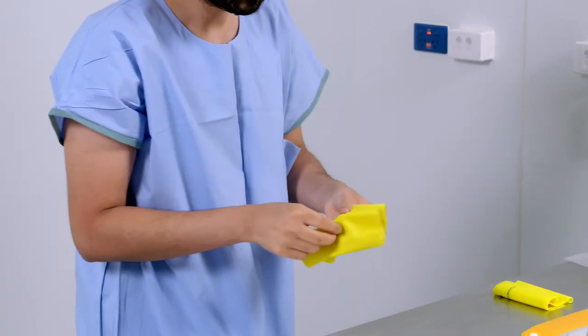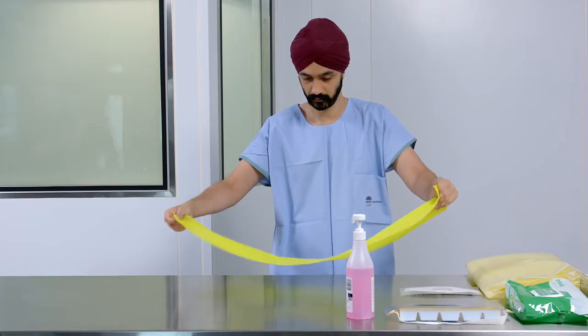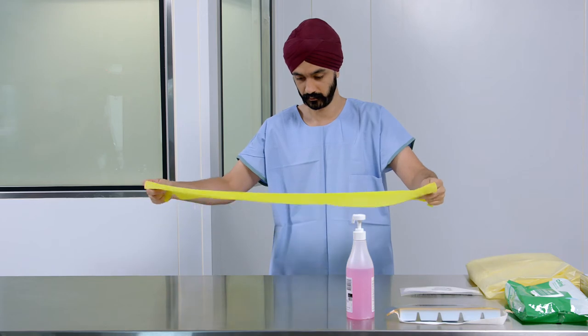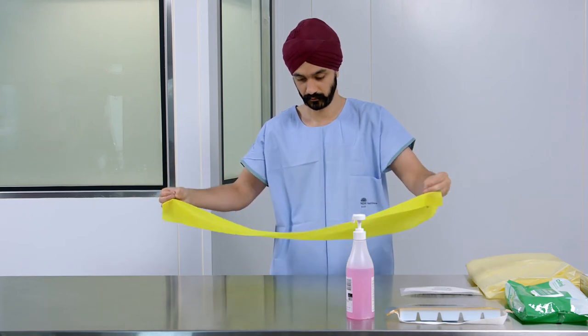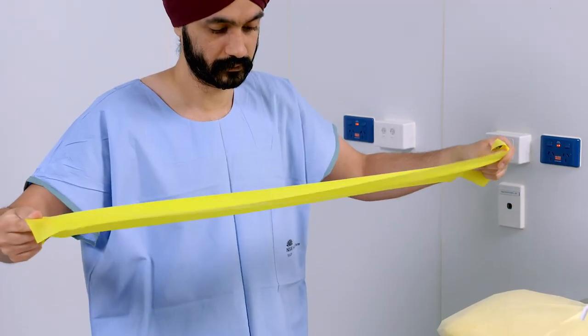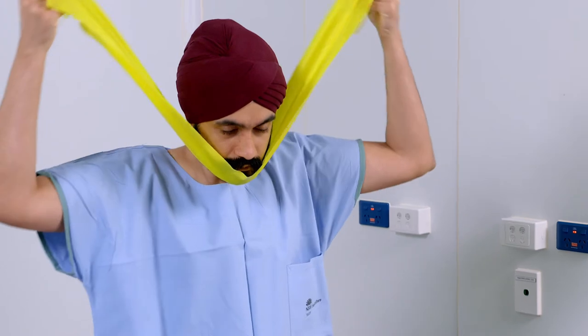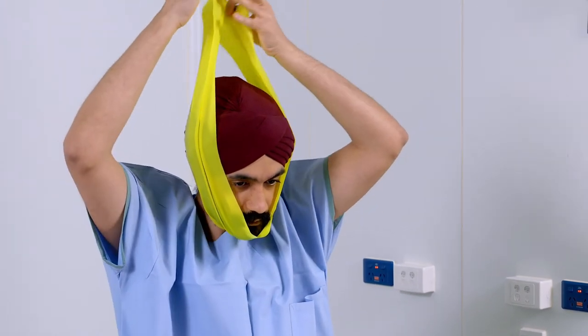Now select the elastic band, ensuring it's the same size as the one used for your fit test. Use each hand to hold both ends of the elastic band. Pull the elastic band under your chin. Bring both ends to the top of your head and tie a double knot as seen here.